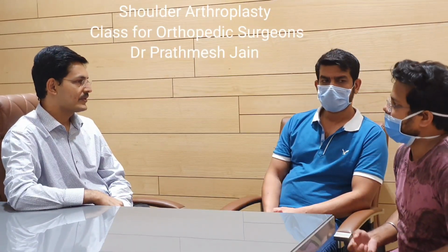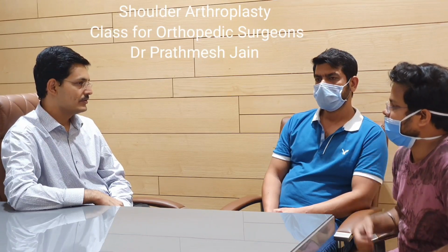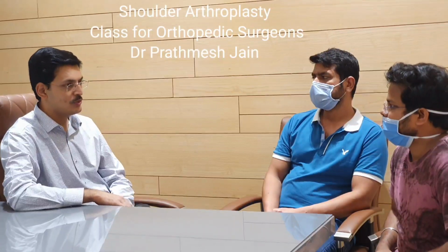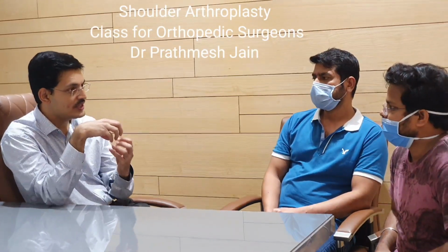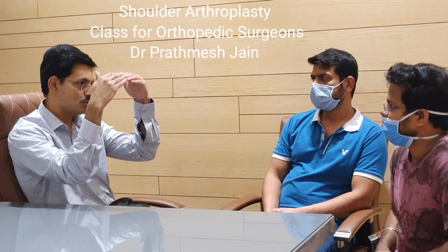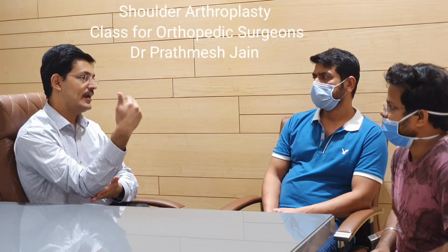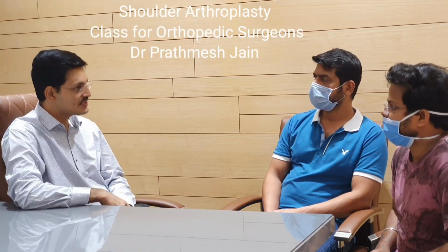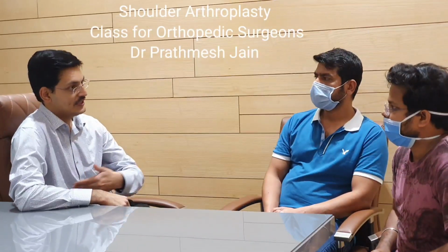If the humeral component adjusts proximally, does it impede the movement? In reverse shoulder arthroplasty, there are very few chances of impingement because the shoulder will go down. Actually, you increase the vertical offset, so you will have lengthening. The arm will be lengthened as compared to the opposite side by about 1 to 2 centimeters. So very few chances of impingement. You have the reverse problem: the problem of notching inferiorly.